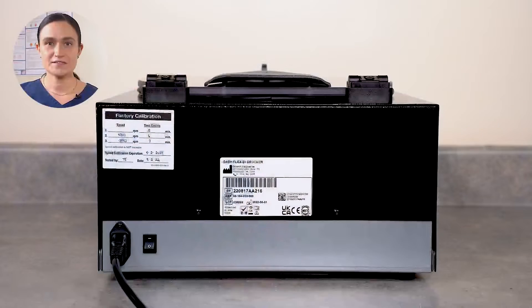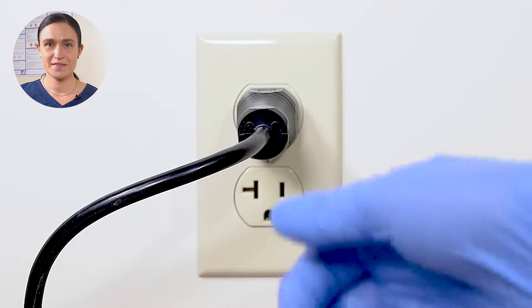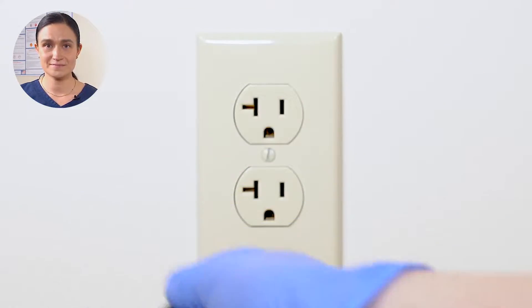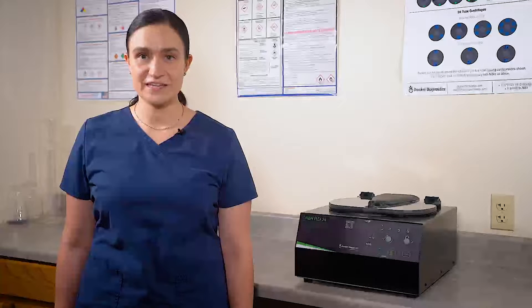Your DashFlex 24 requires no regular maintenance. Cleaning is easy too. Start by turning your DashFlex 24 off, then unplug it from the wall. Your centrifuge should always be off and unplugged before you do any kind of cleaning.